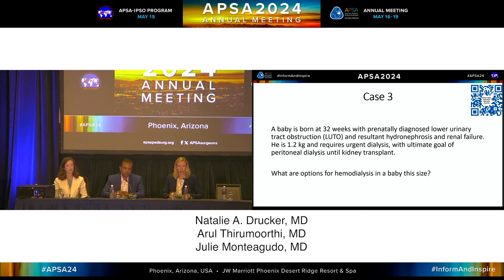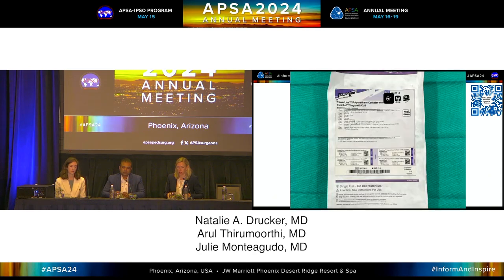So this is something we're seeing more and more. These younger and smaller kids that are being born that maybe wouldn't have survived previously with things like the RAFT trial, kids with oligohydramnios and renal failure are being born and needing dialysis to be supported until they can get on peritoneal dialysis. It used to be, or it is still, kind of a challenging clinical situation, but we've had a good little series of these, so we wanted to share this as information for anybody who's trying to do this as well. This is the line that we typically use in babies this small.